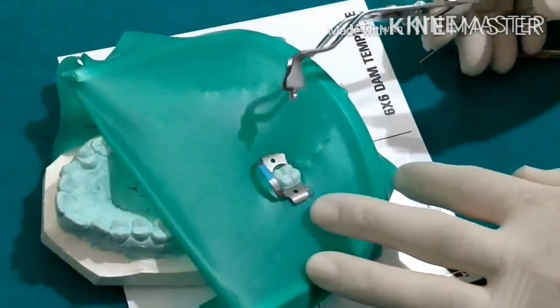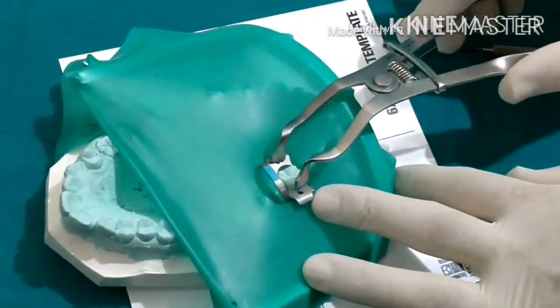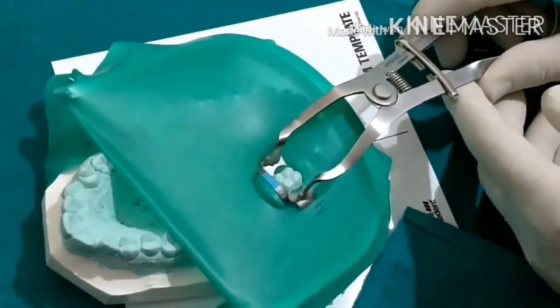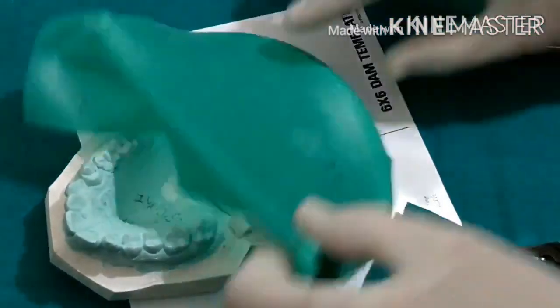To remove the rubber dam from the patient's mouth, put the forceps beaks into one hole of the clamp then the other and expand. Don't rub it against the tooth — just bring it out and you're all done.